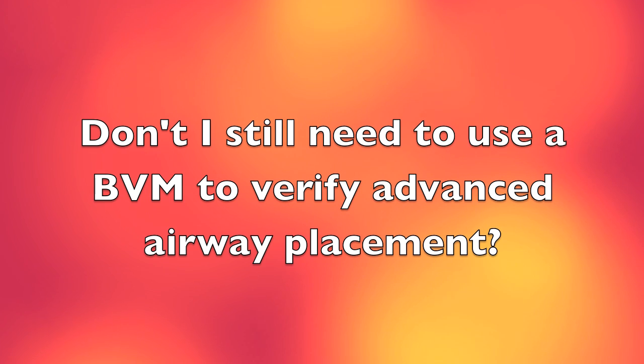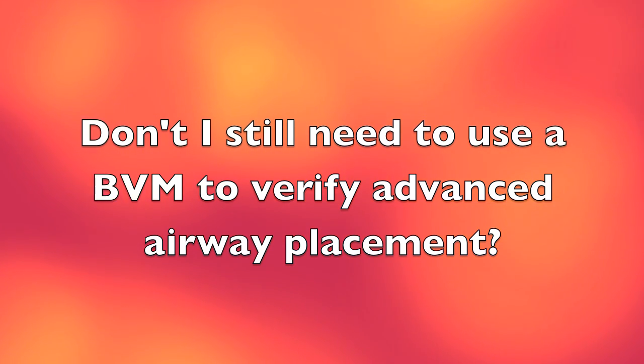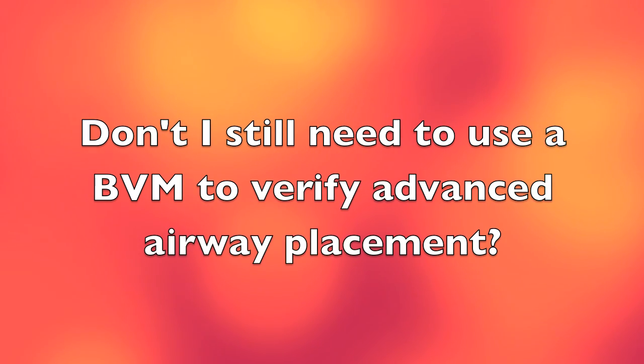You can still use a bag valve mask to check airway placement if you wish, but you can also set the Surevent ventilator and turn up the rate. In this way, you can check lung sounds and epigastric sounds to verify advanced airway placement.